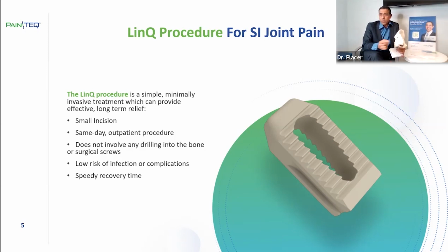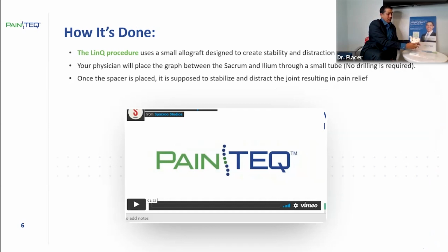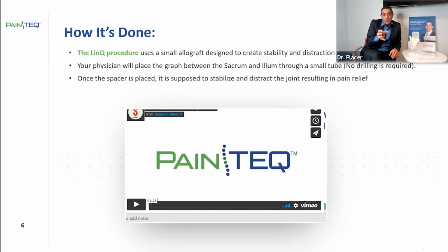If we go to the next one, that's what you were seeing. It's the allograft that I use to insert inside the joint. It creates more stability. Remember, we talked about the gliding motion. We want to maintain that interlocking mechanism within the joint, and this helps as we create a little more space, opens up the space, and creates stability that is well needed inside the joint.